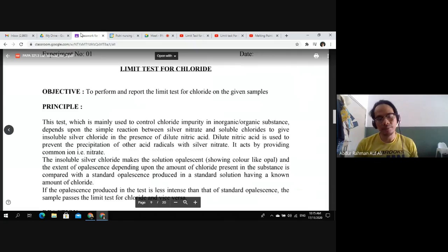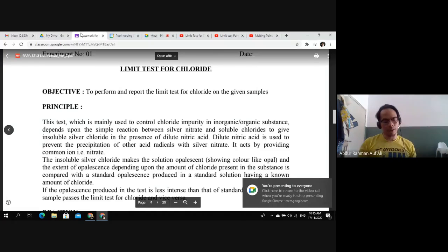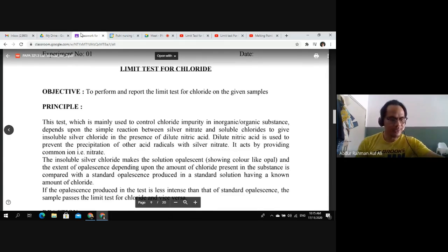So certain substance, certain chemical compound, certain impurities must have a limit before it can be marketed to the public. Okay, because these are drugs that patients eat. So if these impurities, if these chemical substances are digested into the body and that can be collected into your body, dia boleh cause harm.